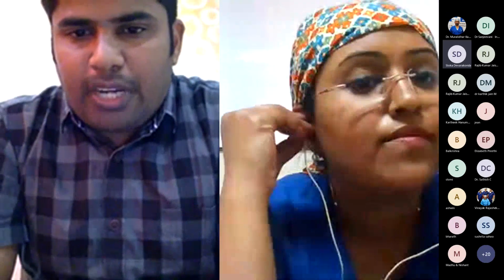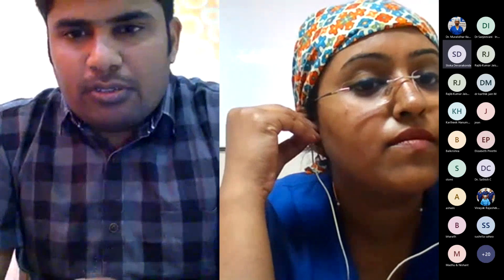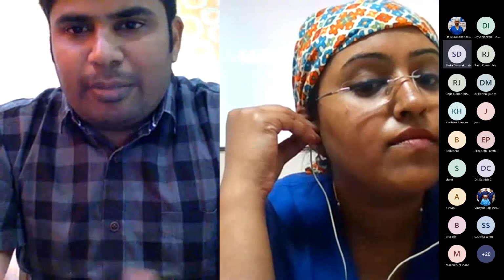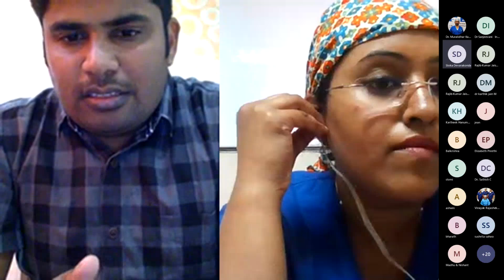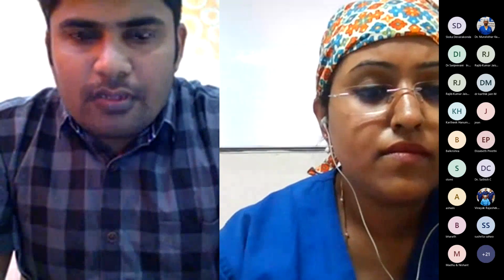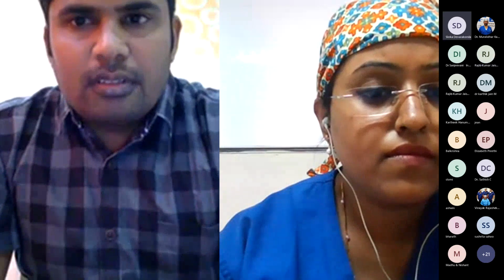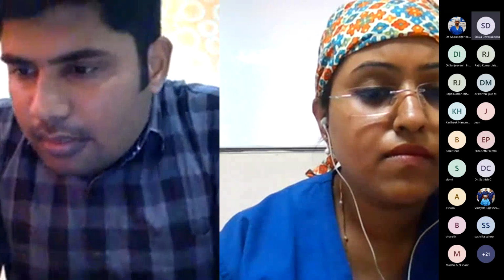Sir, I'm not aware of any contrast between these two, so I can't comment on this. Anybody else in the forum can comment. It's just an observation. Once you get the blood, there is systemic vasodilatation. Yes, ma'am, the diameter of the aorta may be less as compared to preoperative.